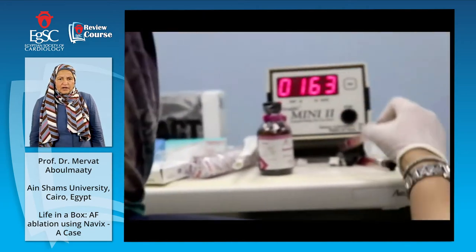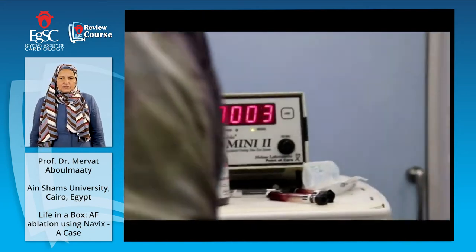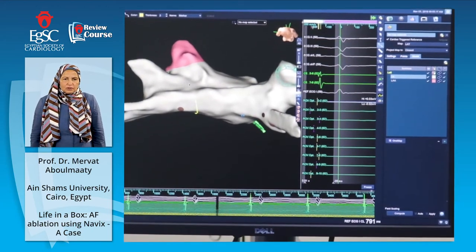We have to give heparin. We start with 10,000 units of heparin, and we have to check the ACT. This is the ACT machine, every 20 minutes. Then I make an anatomical map if I don't find scars or a low voltage area.